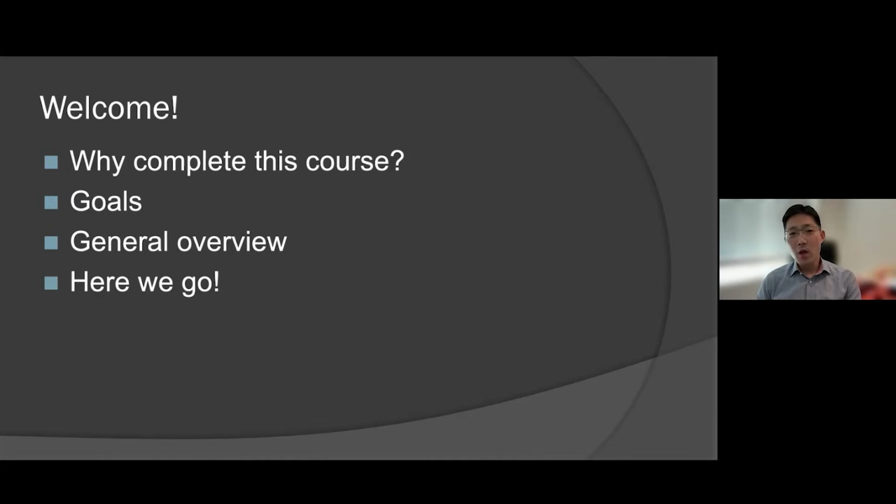The general overview of how we're going to approach this and really get it categorized in our minds is that we're going to use a pattern-based approach. We're going to start with pulmonary fibrosis. We're going to have a section on nodular lung disease, a section on cystic lung disease, and then a section on interstitial lung abnormality and progressive pulmonary fibrosis.